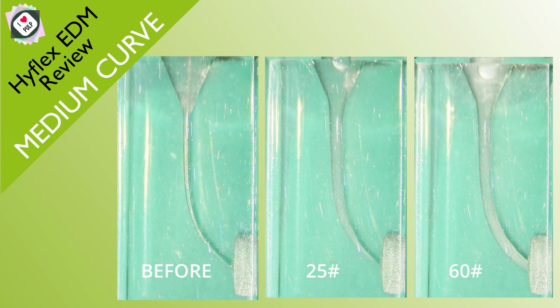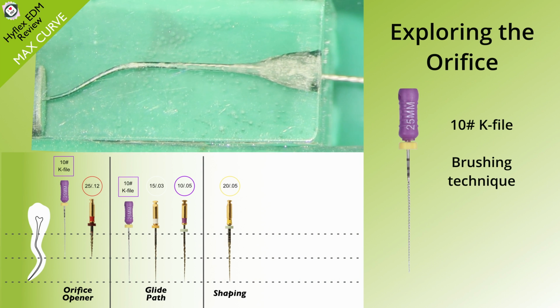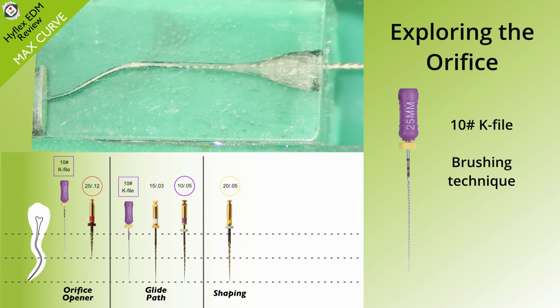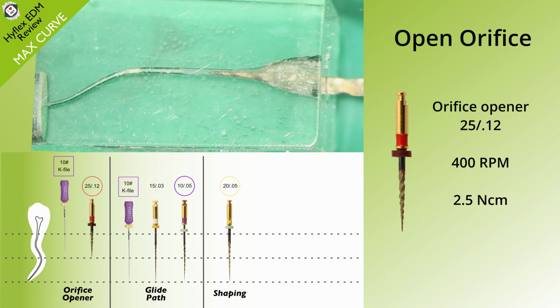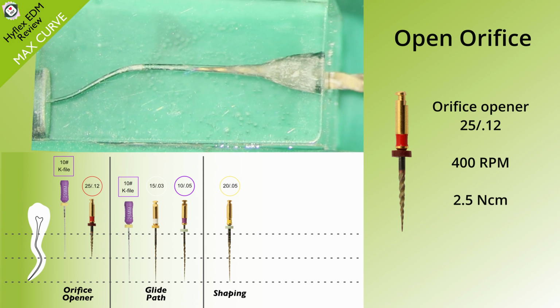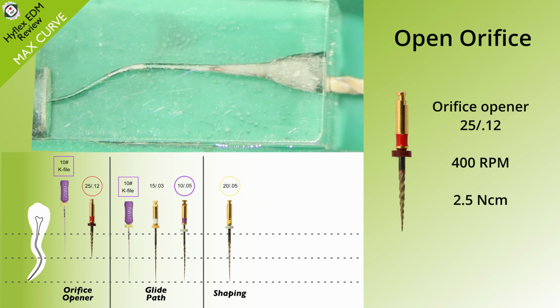So when comparing the before and after shapes, the size 25 looks really nice, and it's shaped that medium curve beautifully. The next protocol is the max curve. So again, we're going to explore the orifice with the size 10K file using just the brushing technique. We're then going to use the dedicated orifice opener to open up the orifice, create a nice path for irrigant, and help us guide the file into the canal space. Nice and easy.